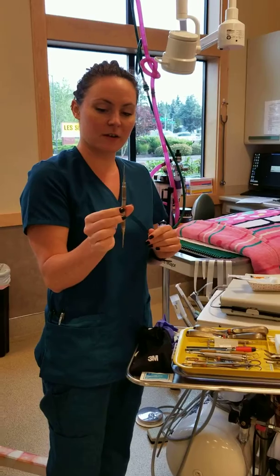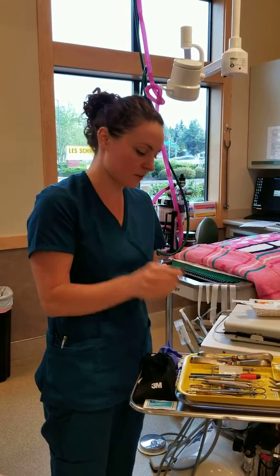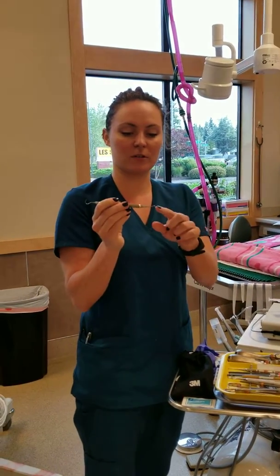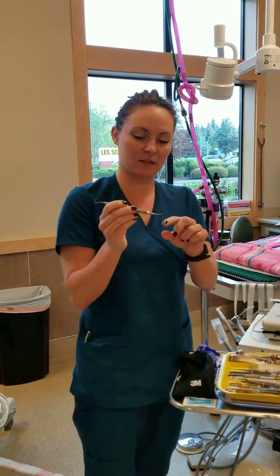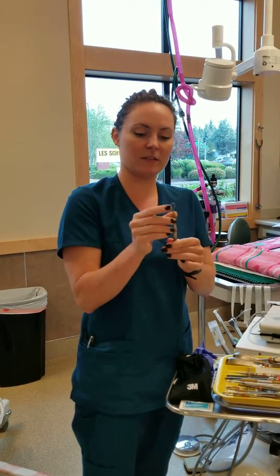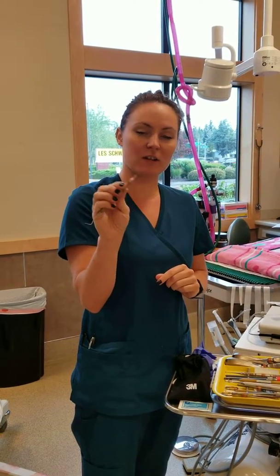Then this is a perio-osteal elevator. This is for creating gingival flaps. And then here we have our explorer. We've got our probe on this end to measure the pocket depth in the mouth, and then on this side we have our shepherd's hook, which can also be used on the gum line to check for calculus.